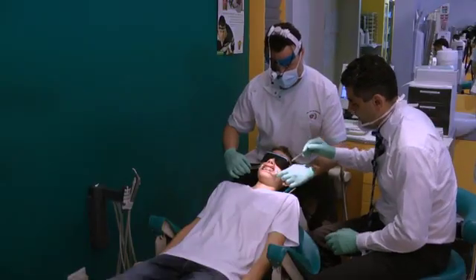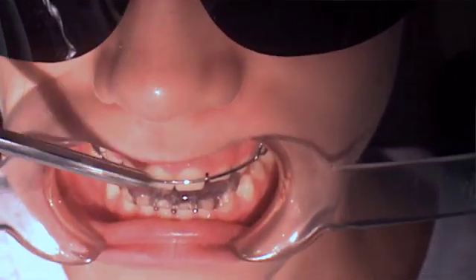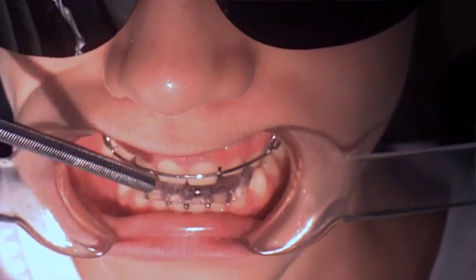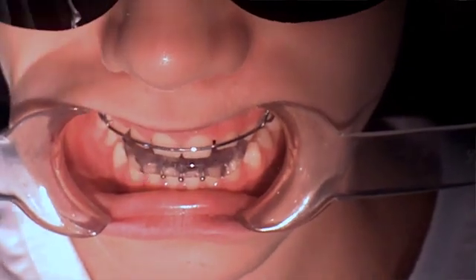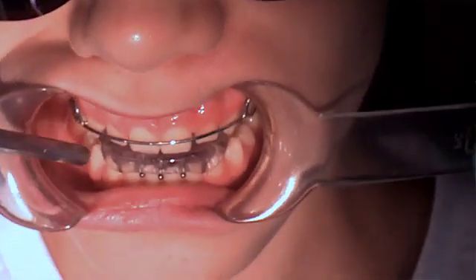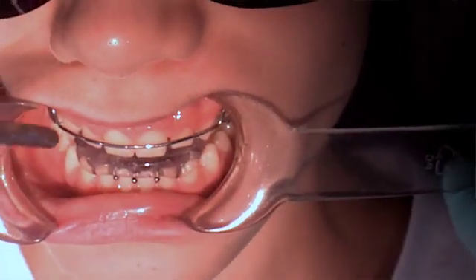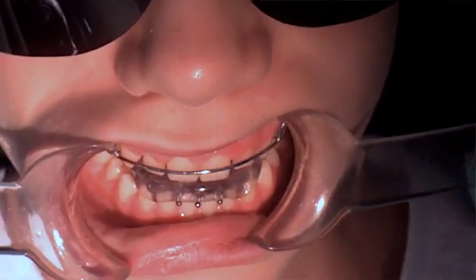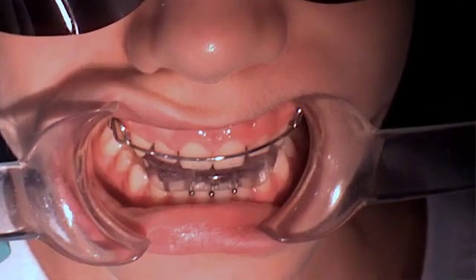If we look at the design of this bionator: the labial bow helps with retention. One thing to be careful of — if it's too active, you'll start losing torque on your incisors and you don't want that division 2 appearance. In the buccal segments there's certainly space for eruption, and we can trim the acrylic in a mesiodistal direction to allow the molars to erupt into a class 1 position.